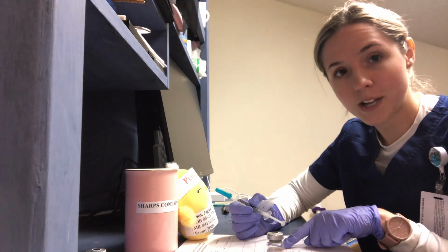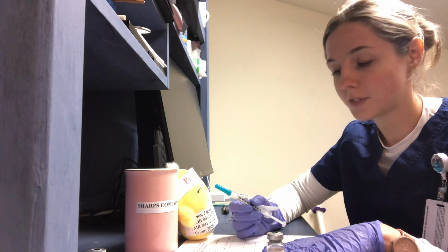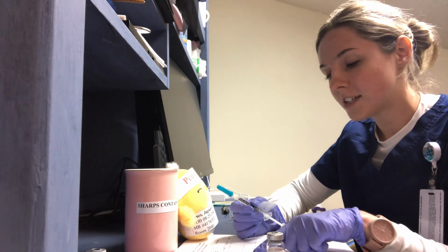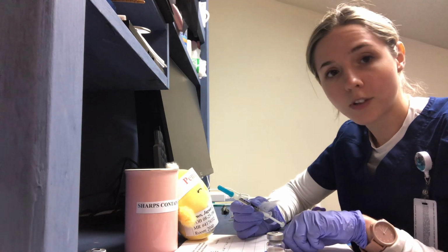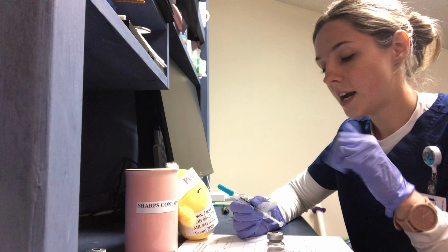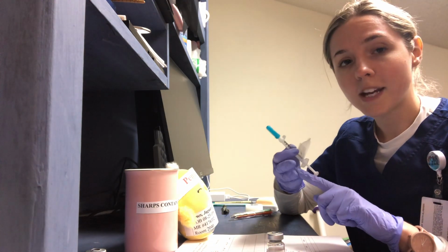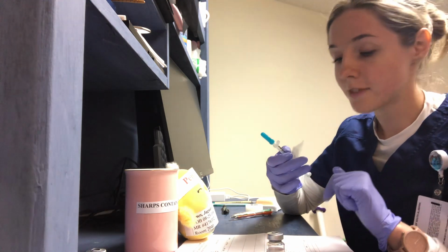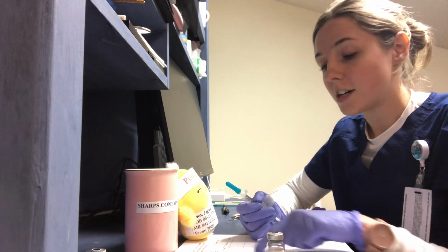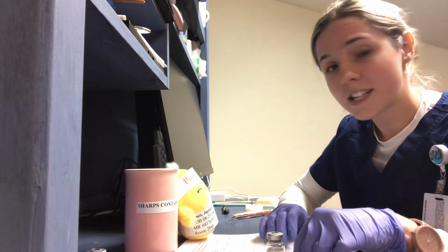He has not had it in the past 12 hours, so that is great. The right indication to prevent blood clots, and the right documentation. Everything is documented correctly. Nothing is missing for illegal documentation. Perfect. So I'm confident that everything's good. I've already checked his allergies. Right patient, right medication, right dose, right route, right time, right indication, and right documentation. So I feel pretty confident. I'm going to select my injection site.